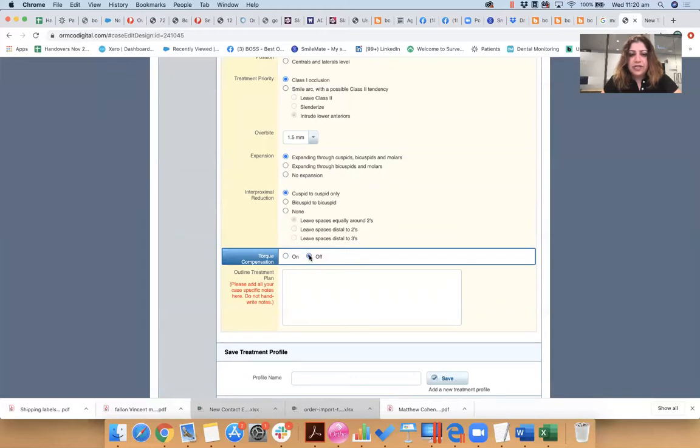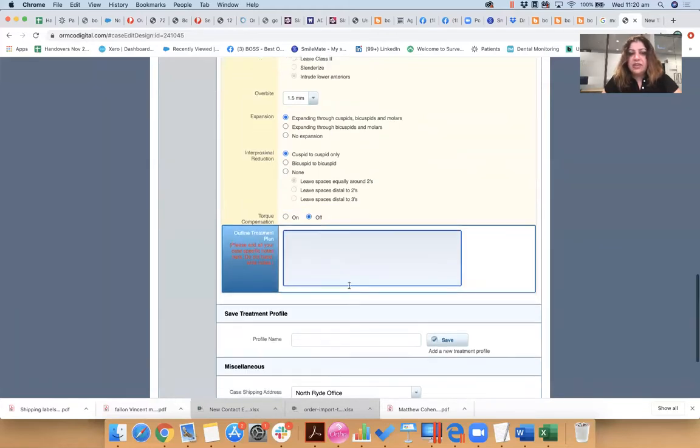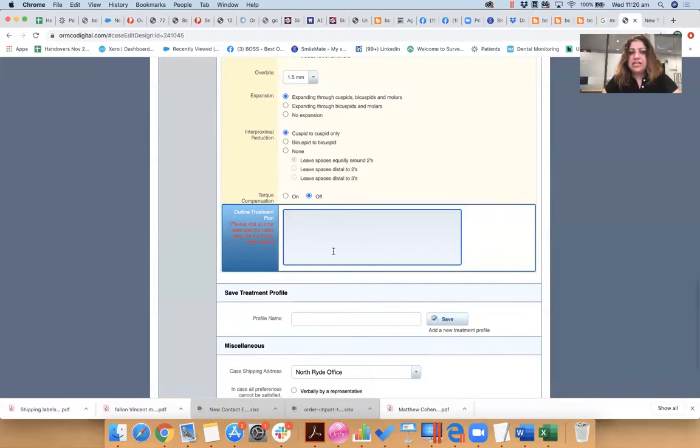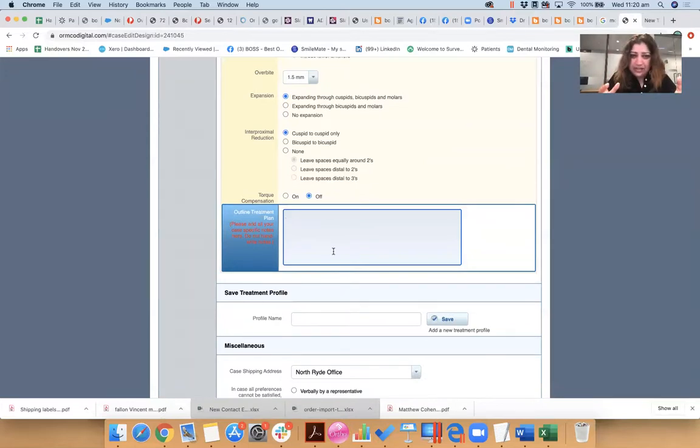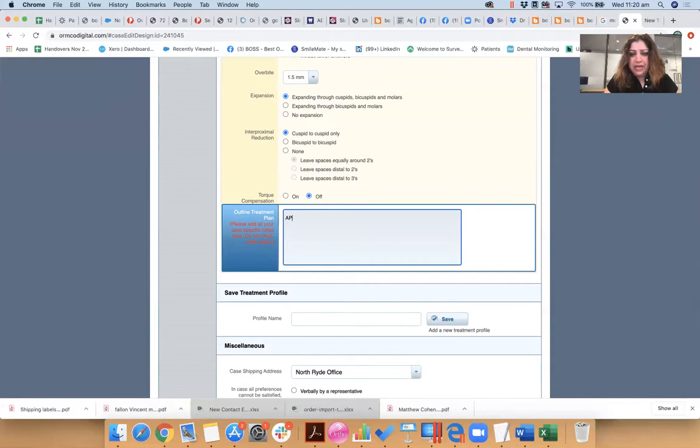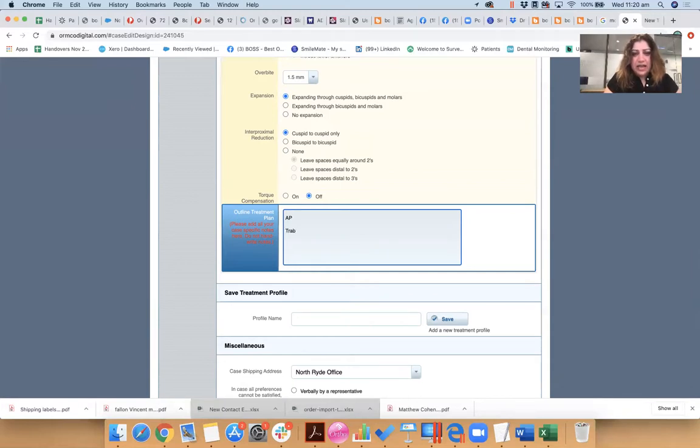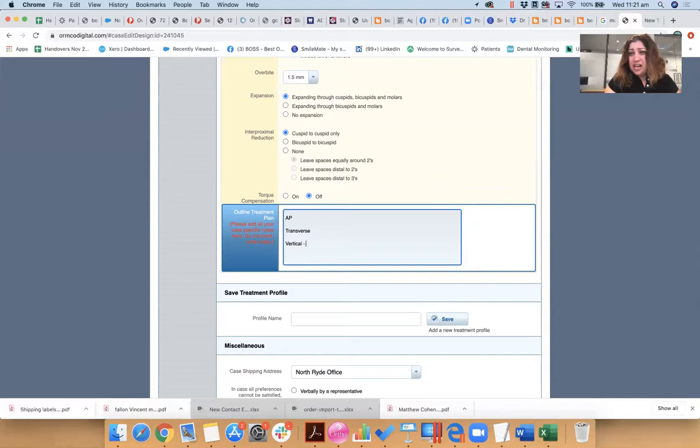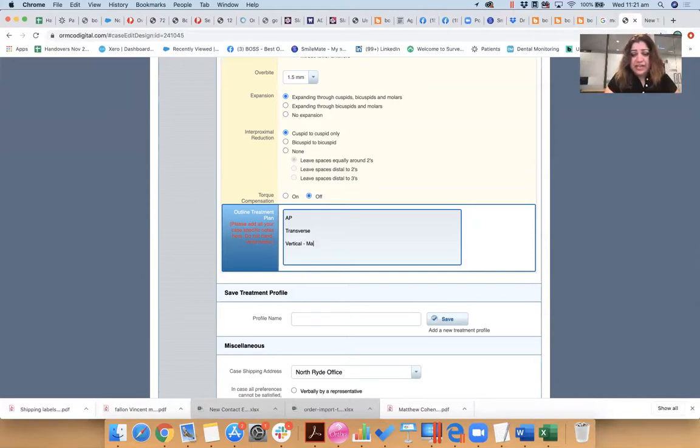Torque compensation, whether you can leave it on or off, I usually leave it off, okay. And here is where you need to dictate to the technician everything about this case. Okay? What are you going to do in AP? What are you going to do in transverse? Okay? And what are you going to do in vertical?